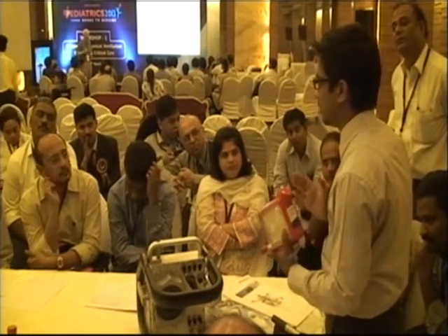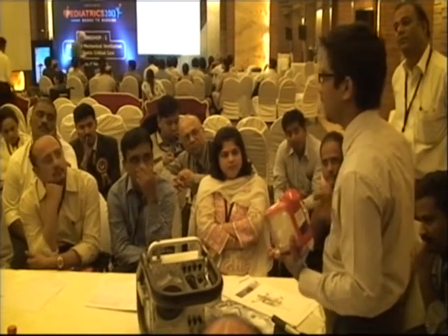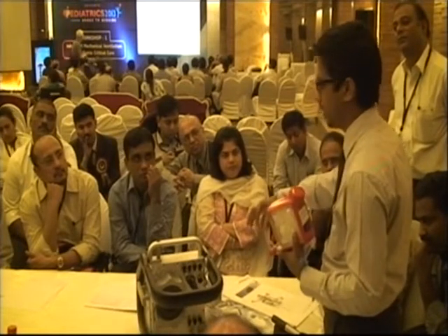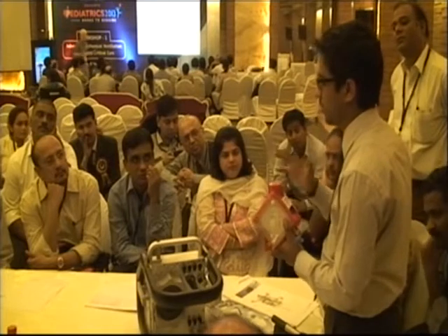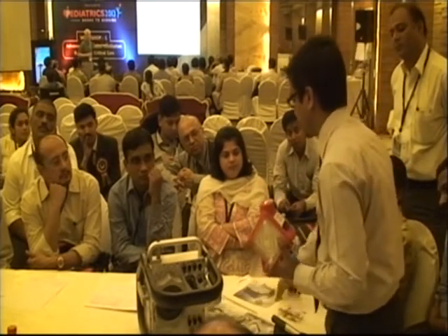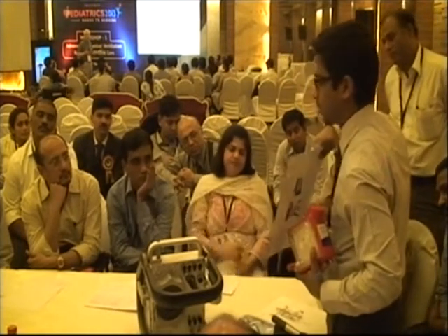When you have a severe cardiac failure or a combination of lung plus heart, that time we may have to have a veno-arterial ECMO. So the blood comes out from the vein and gets into the system, oxygenates, CO2 is removed, and this pump, there is a pump over here. In the first generation machine it was different, it was separate.